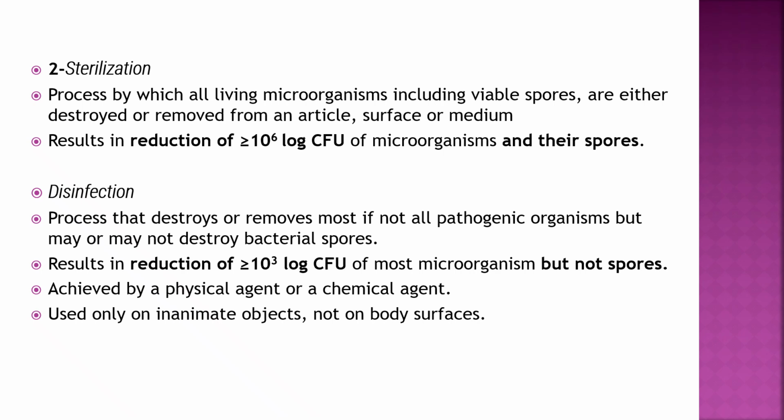Sterilization is the process by which all living microorganisms, including viable spores, are either destroyed or removed from an article or from the surface medium. It results in a reduction of more than 10 to the 6 log colony forming units of microorganisms and their spores.